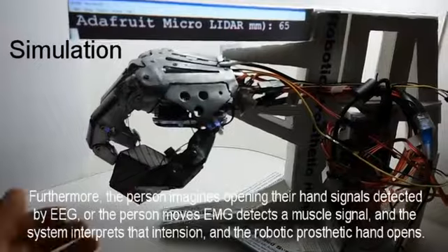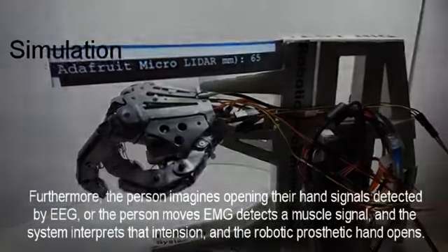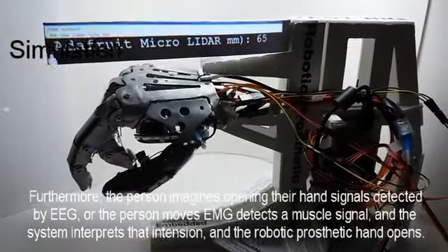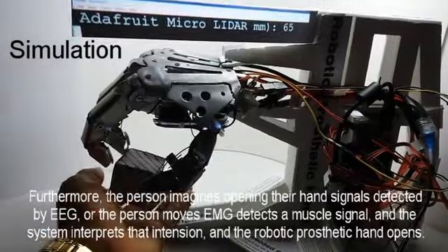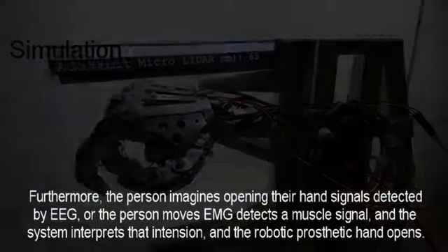Furthermore, the person imagines opening their hand, signals detected by EEG, or the person moves, EMG detects a muscle signal, and the system interprets that intention, and the robotic prosthetic hand opens.